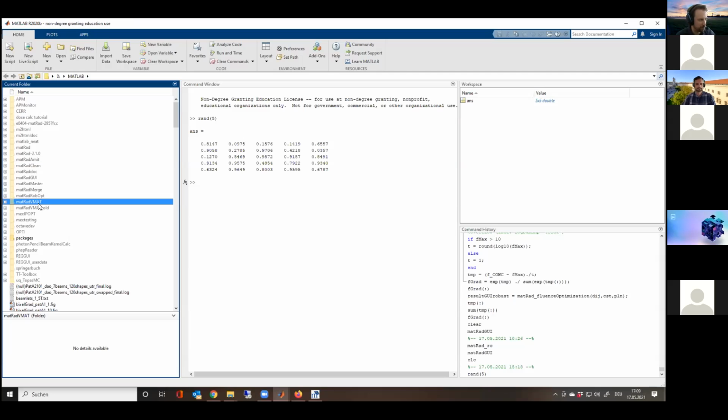So, for example, a primary example of some new functionality that we integrate in cooperation with a group from Canada is the VMAT stuff. So VMAT is rotating therapy. Arc therapy is also similar to VMAT. It's another word to some extent, but you can also mean different things. But that's one example of how we interact with other researchers. So this is something that I'm currently working on integrating, for example.